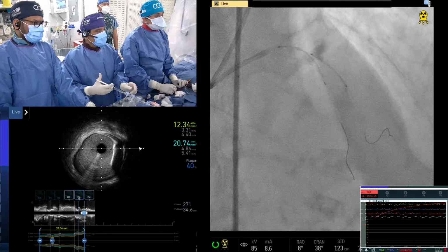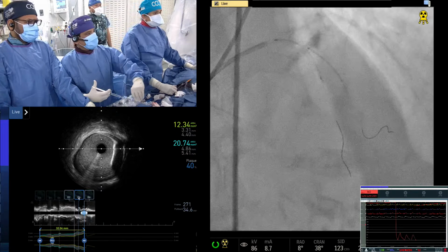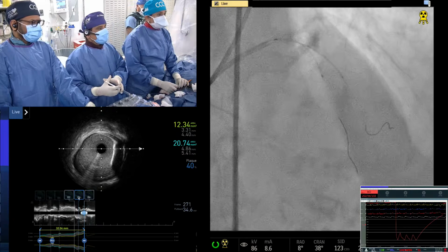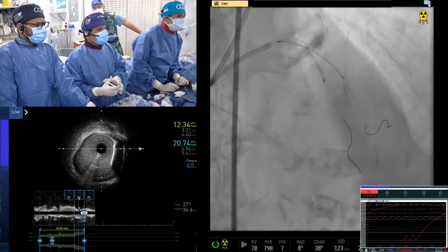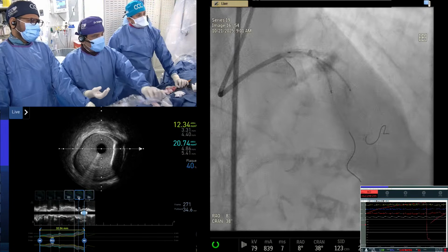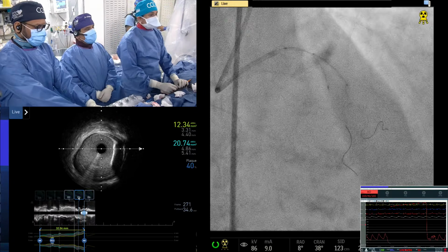Okay, now. We are advancing the stent. You can do a little more if you need to. No, no, no. Okay. Ready? Take a picture. Then we start. Pull back. Left main, diagonal is good. Actually, very good. Okay. Ready? Maybe it will be too much now. Yeah. Have to go in with the LAD a little bit. Both. Right? Yeah. Even diagonal. Look at the diagonal. Lot of overlap. Both 2 millimeter in.